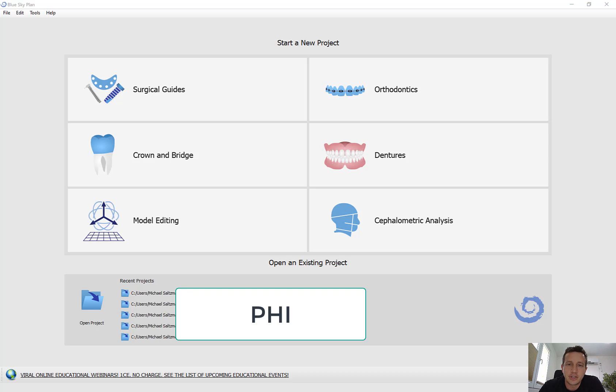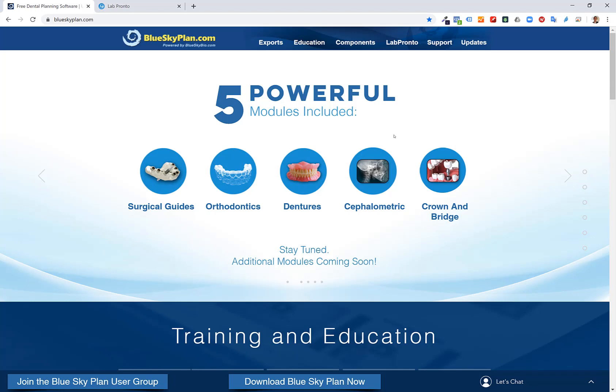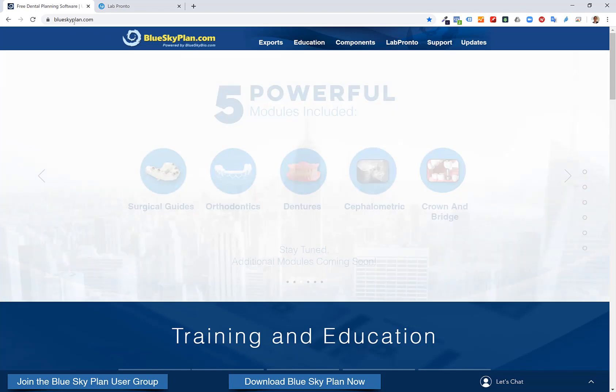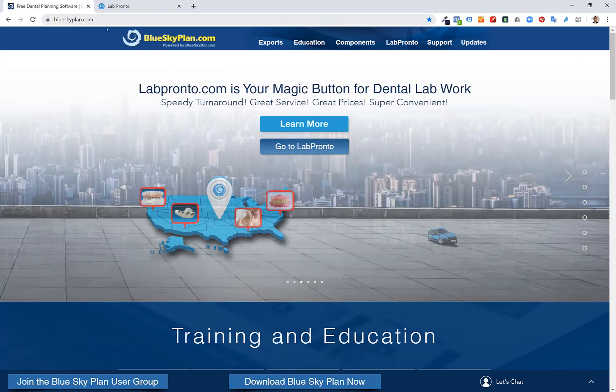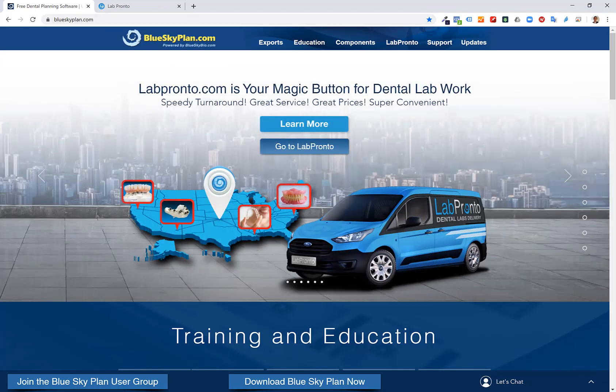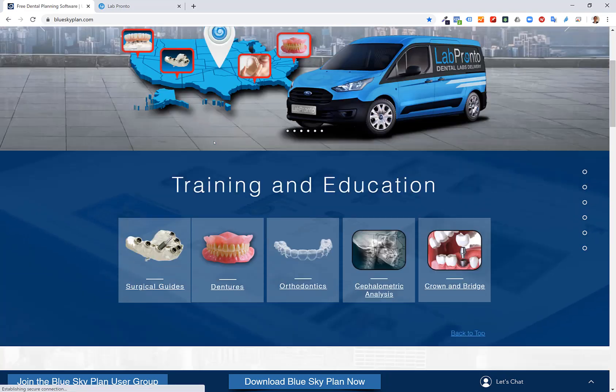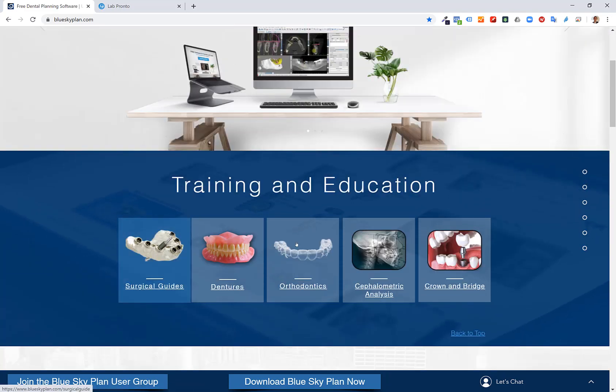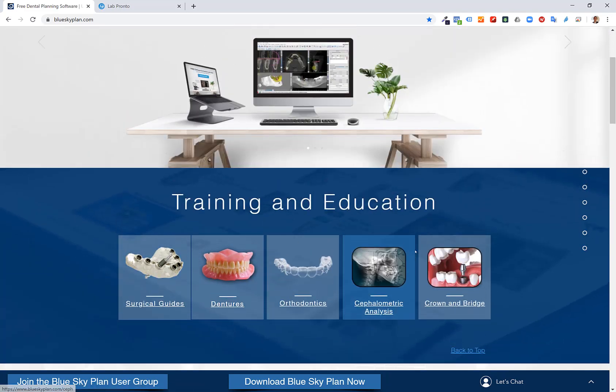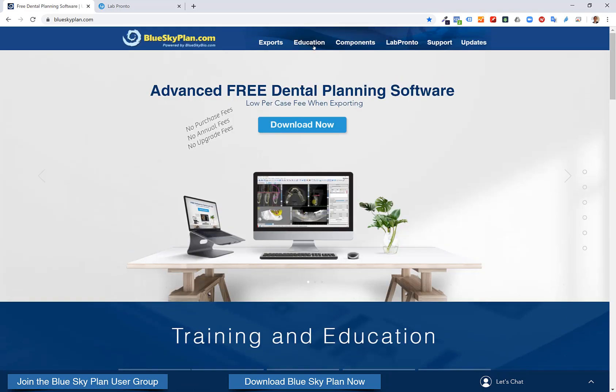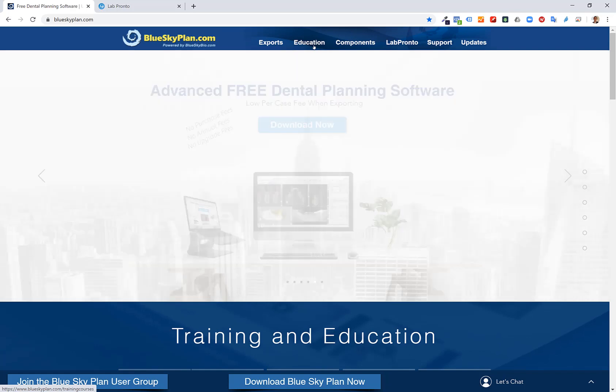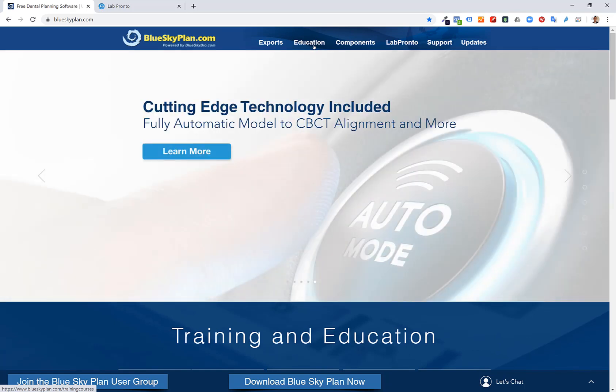This functionality is currently free and is going to stay free for quite a long time. Before we jump into the software, I wanted to bring your attention to BlueSkyPlan.com, the education section that can be accessed by scrolling down slightly or by clicking education in the top horizontal toolbar.